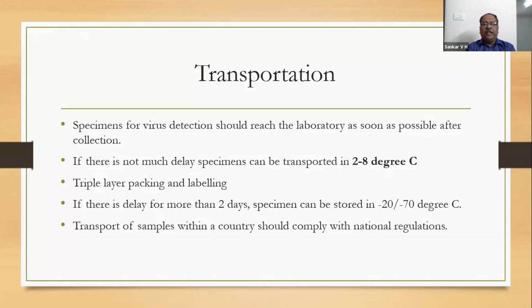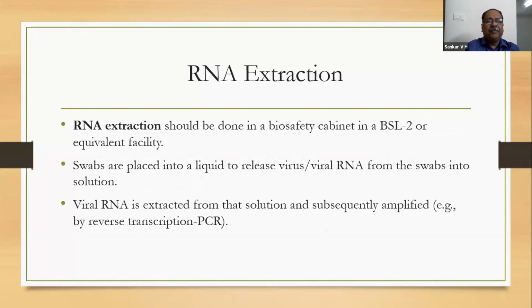Transport of samples within the country should comply with national regulations. If sending outside, which is not required now, international regulations also have to be followed. Swabs are placed into a liquid to release virus and viral RNA into solution, and RNA will be extracted from the solution. This area is a little tricky because there is a chance of contamination to other people.